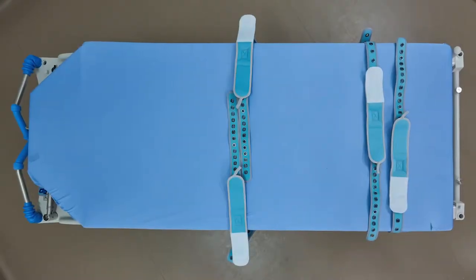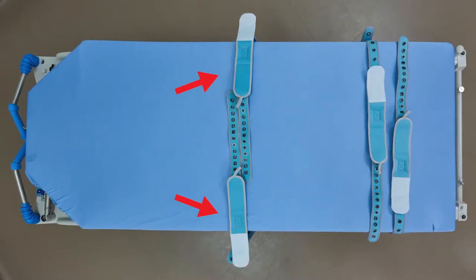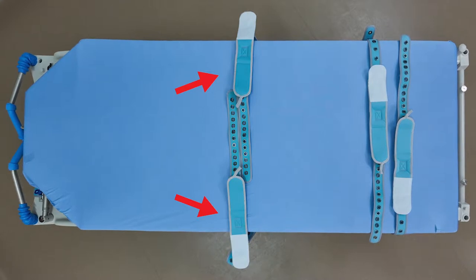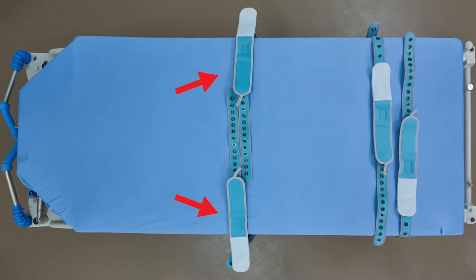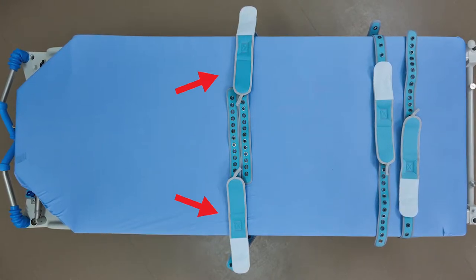Lay the cuffs on the stretcher or bed in the proper position to connect to the patient. The cuffs should be far enough apart that the patient can't reach across or touch them, but close enough that you can link them in the middle if needed.